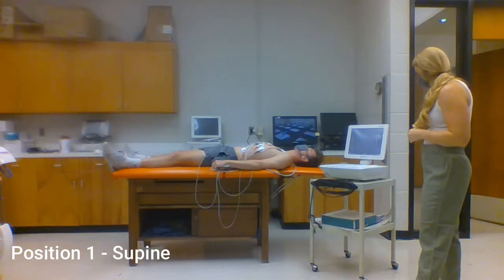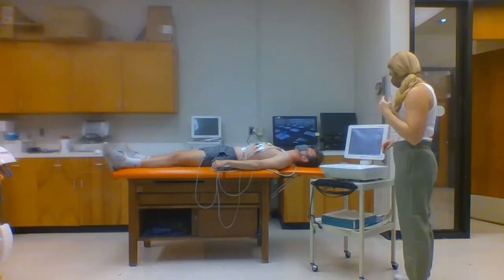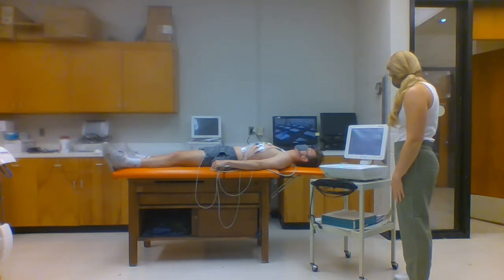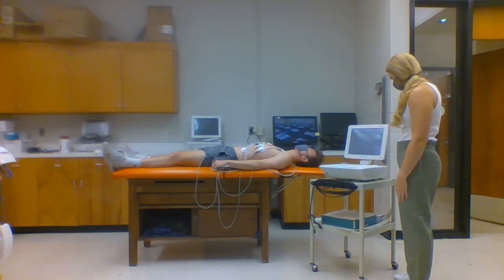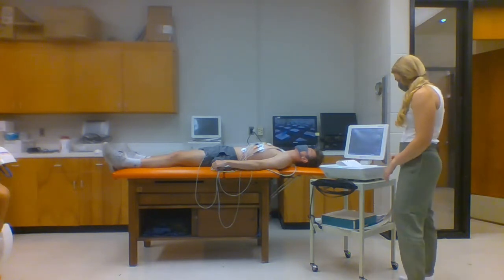We will observe any changes in the ECG recording as our participant changes positions. The 2 positions we're looking at are a resting ECG during a supine position, which is our subject laying flat on their back, and then in a standing position. The participant will start in a supine position and continue to lay as still as possible for the remaining 2 minutes. These 2 minutes allow the heart rate to get back to a resting baseline. At the 2-minute mark, or when the heart rate becomes steady, we will continue to print the ECG tracing.